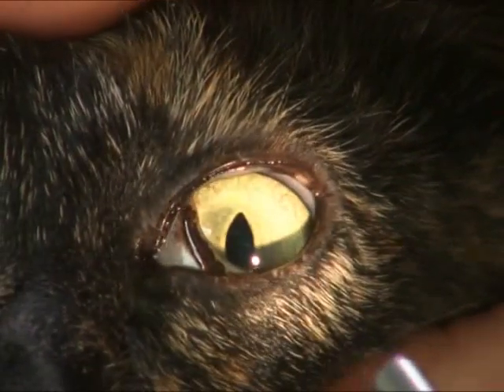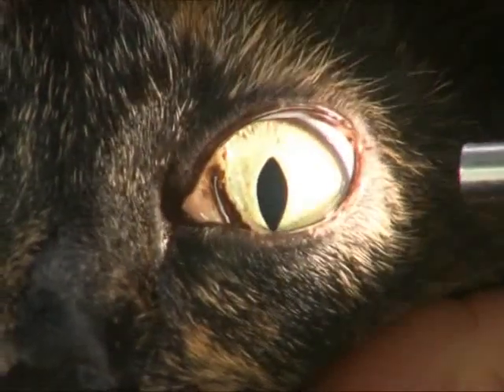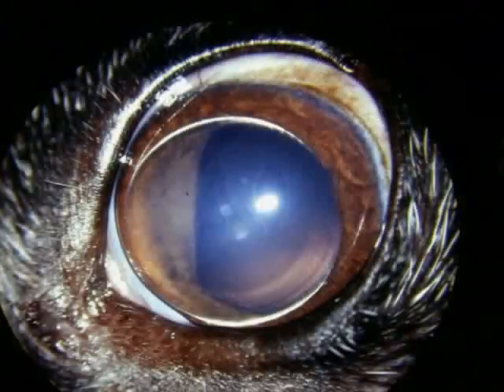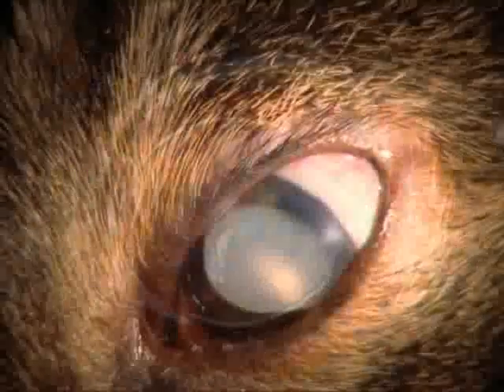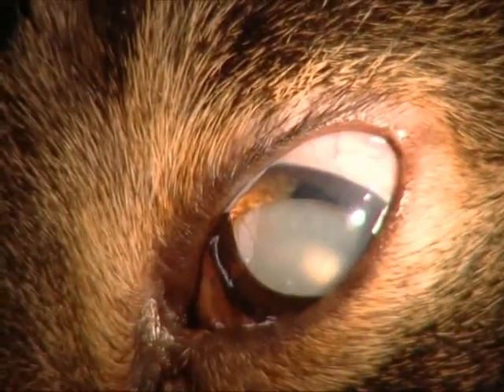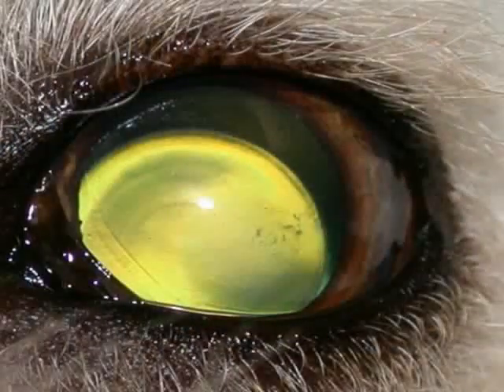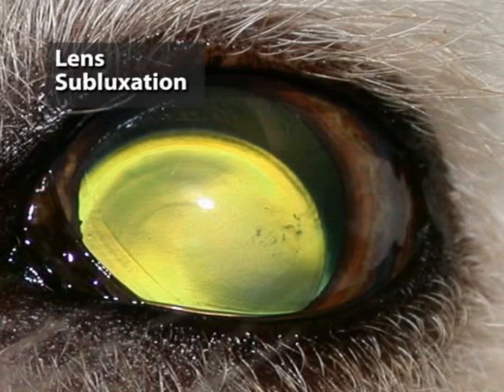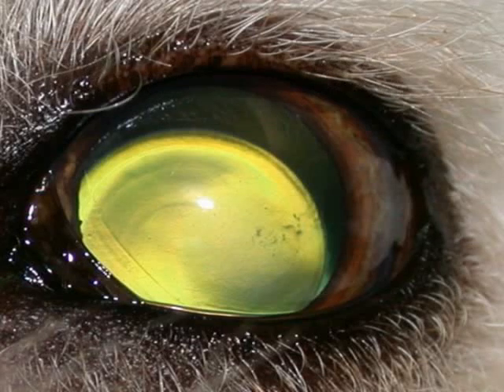The lens can be difficult to examine with the naked eye, but obvious changes should be noted. Anterior lens luxation is usually readily detectable, but may be more obvious when the eye is viewed obliquely. Partial luxation, or subluxation, appears as an aphakic or lens-free crescent between the pupil margin and the lens.